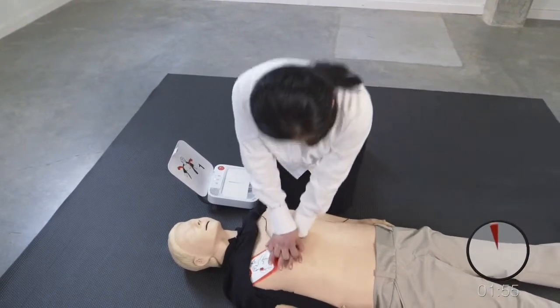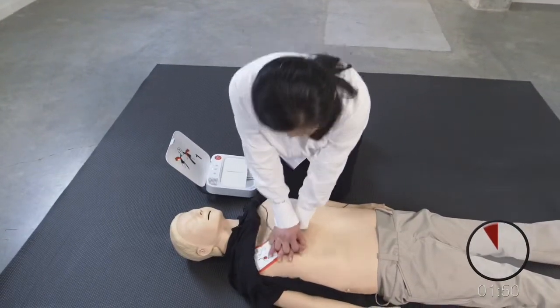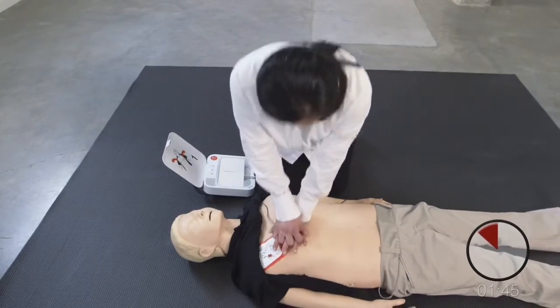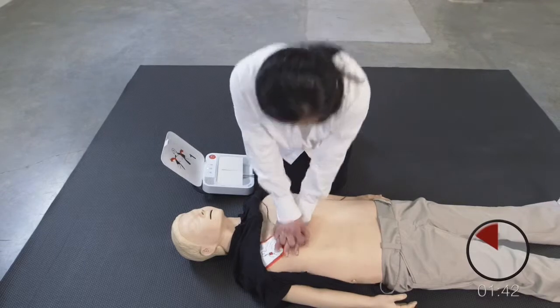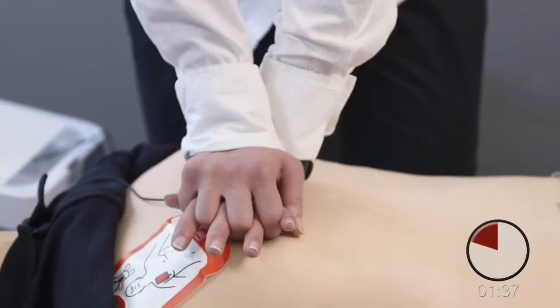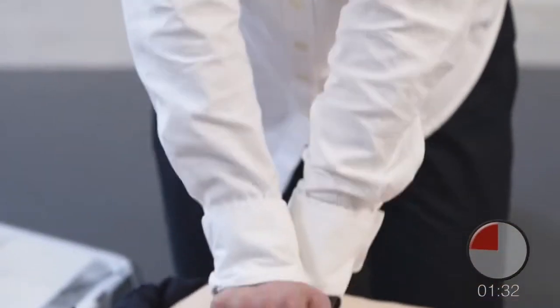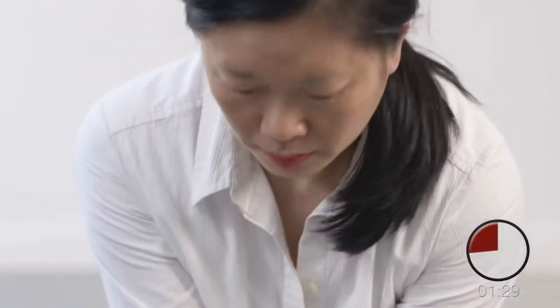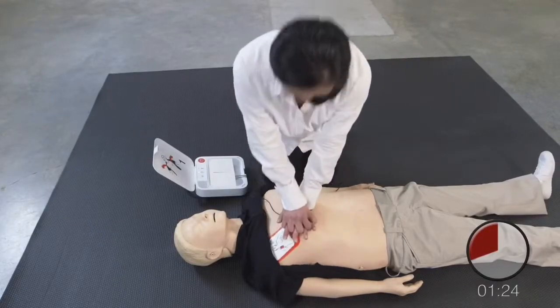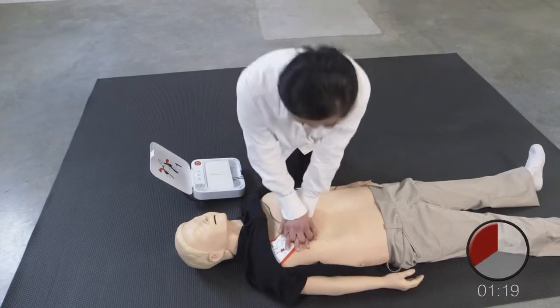Provide chest compressions to the beat. The heel of one hand should be in the center of the chest; the other hand should be on top of the first hand. Push down hard at least five centimeters. With CPR coaching and a metronome, this device will guide you with compressions. Lean over the patient, keep elbows straight.